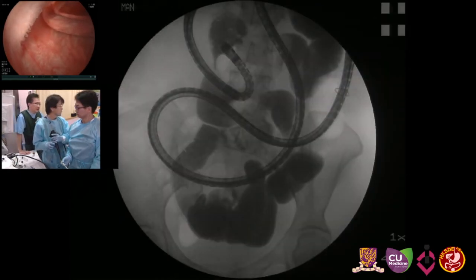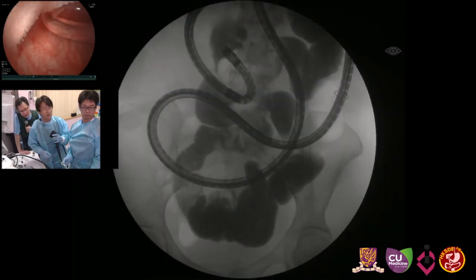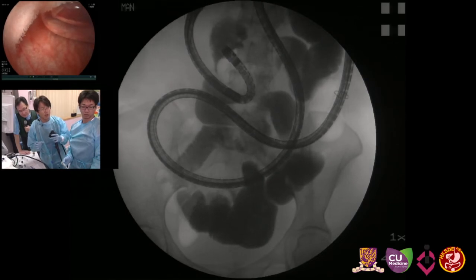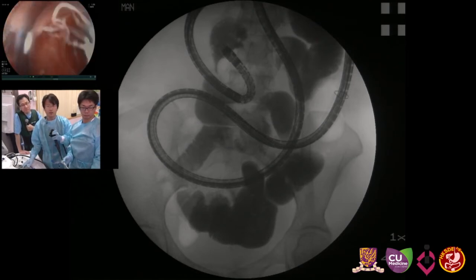Yeah, we don't have that here. The press, the paddle, that transparent paddle, to squeeze on the abdomen. And then what I would do is examine the small segment of the small intestine from the stomal side. That's my plan. Then we can evaluate the activity of her disease and complications like a stricture.